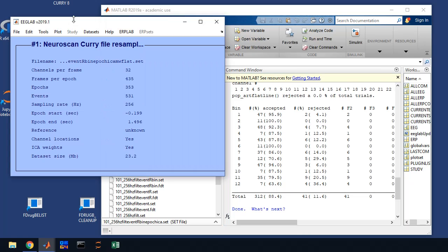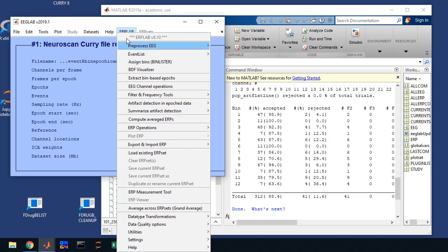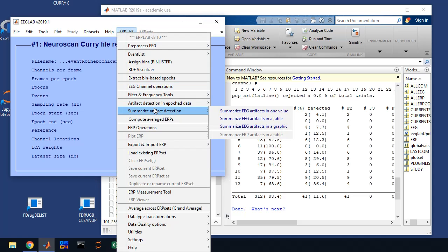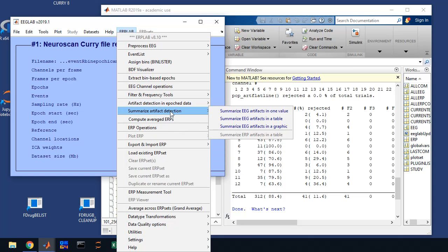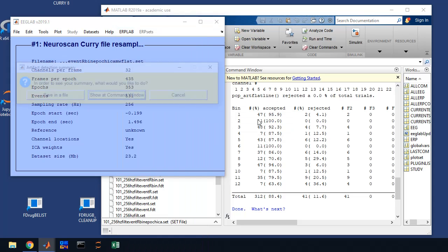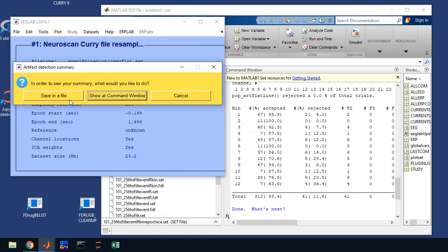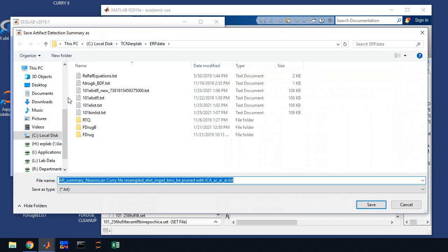So we're going to summarize the artifact detect, because this is just in a window, MATLAB window. Once we close MATLAB, it'll be lost. So we're going to summarize artifact detection in a table, and you're going to save it in a file.